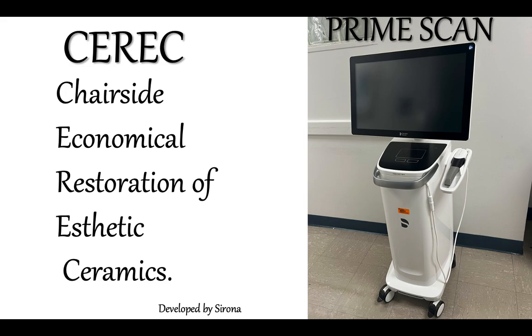And then there is the OmniCam, the older version of this. I did not bring a picture for that, but in some offices it is still present. It's very old at this point. It has a little ball in the center of the touch screen area, and the little ball is pretty much the mouse.